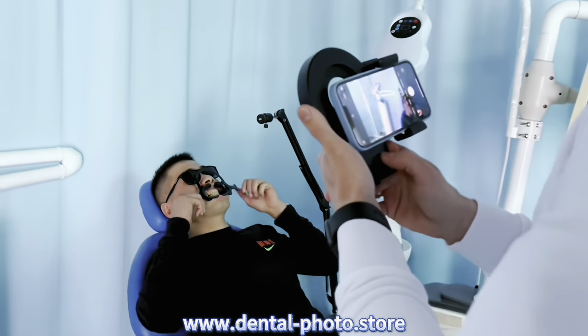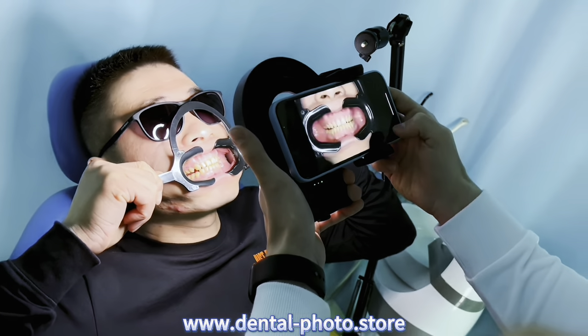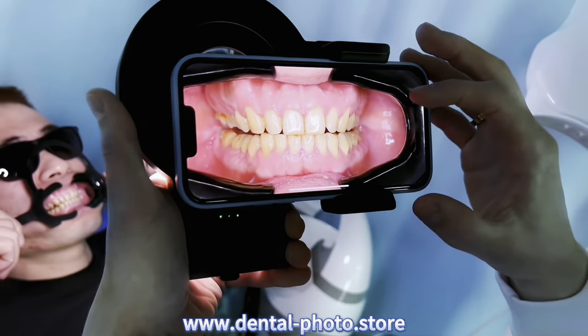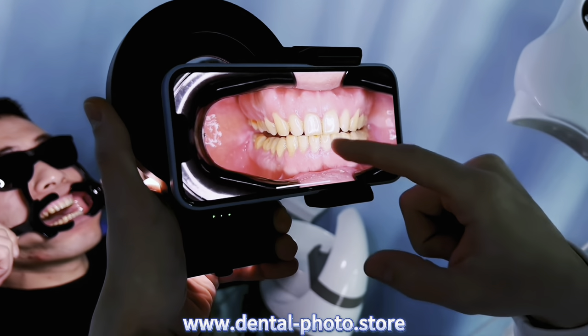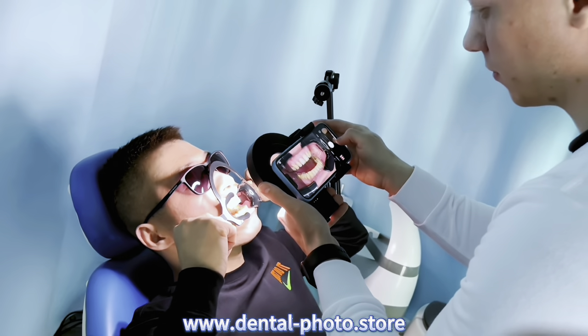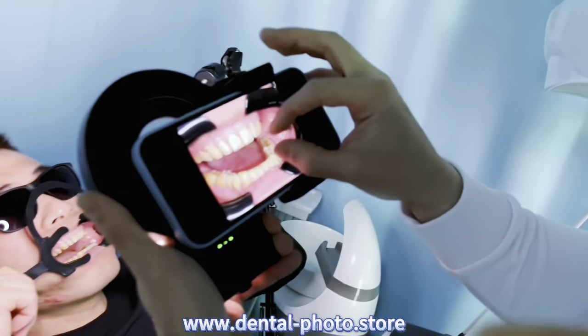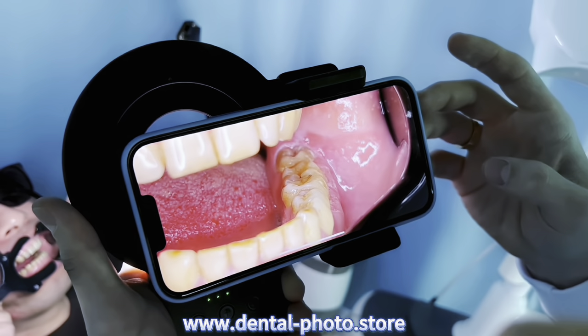I'm going to use the cold light on the maximum brightness. And first of all let's take a photo of the front teeth. As you can see the light is sufficient to illuminate the whole oral cavity including the molars. And now let's take a photo of the molars. Here as you can see the quality is really good. So this is the best solution for dental photography.